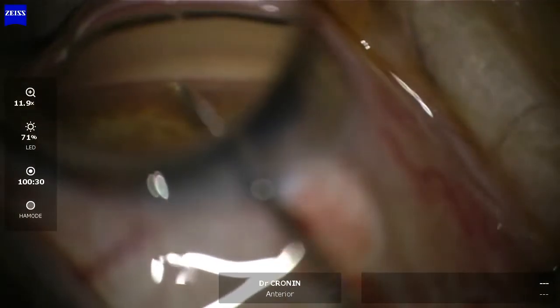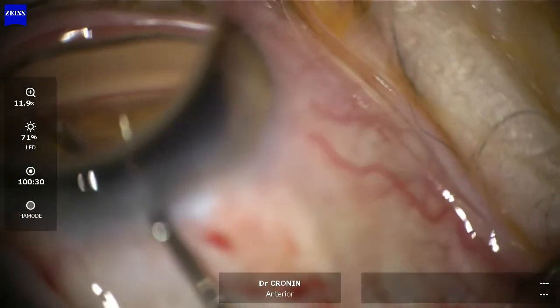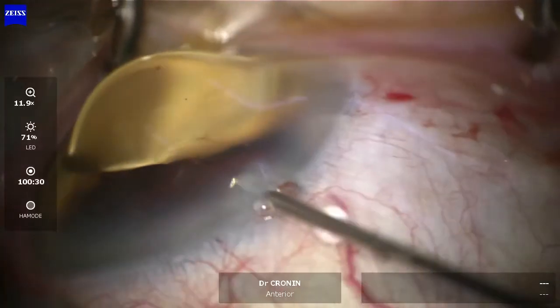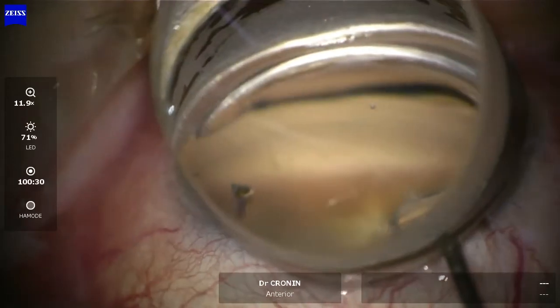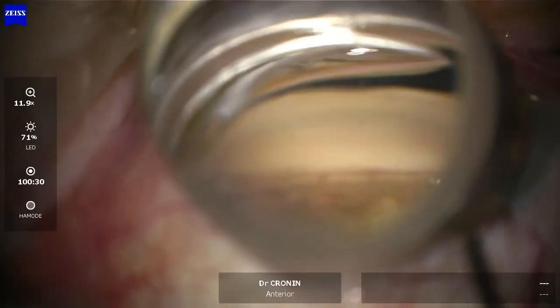It's important not just to be incising the trabecular meshwork open like we do in a pediatric goniotomy, as those flaps tend to seal up and the benefit of the surgery wears off over time. By actually removing the trabecular meshwork, we're removing the obstruction to the outflow of fluid in these patients, and they really can get some excellent results from surgery. Many patients will achieve complete independence from drops for a long time.